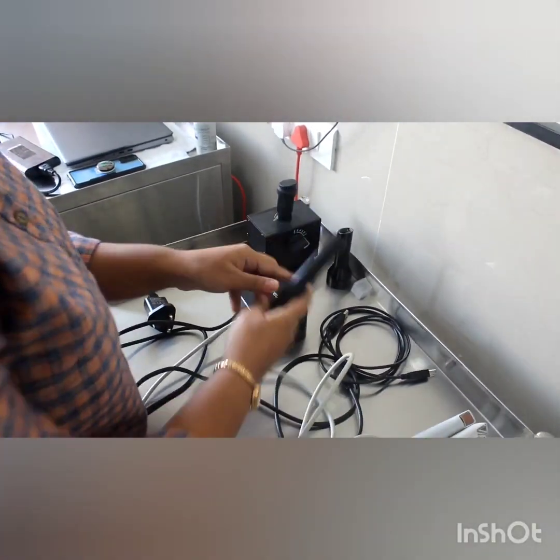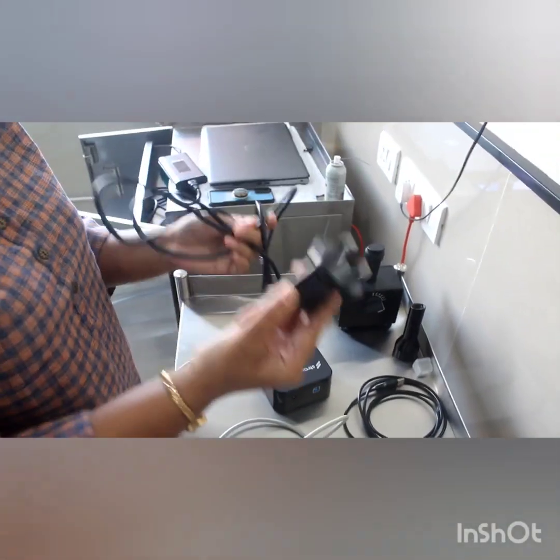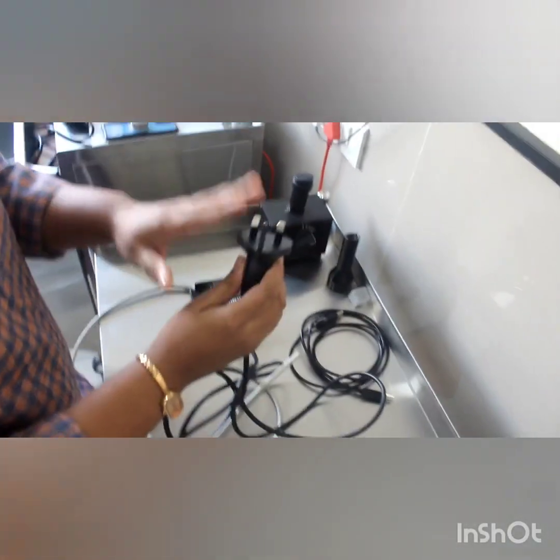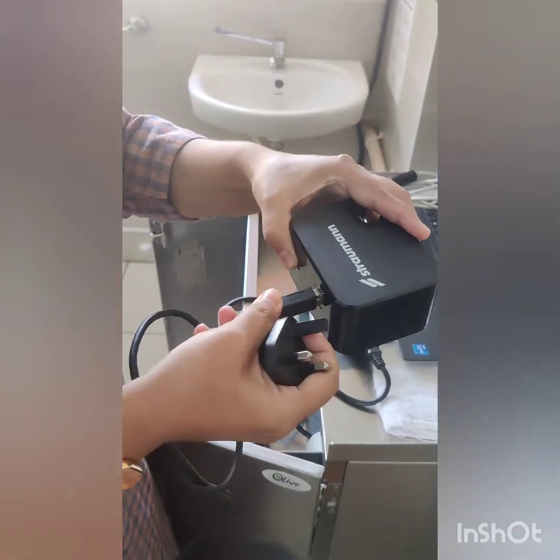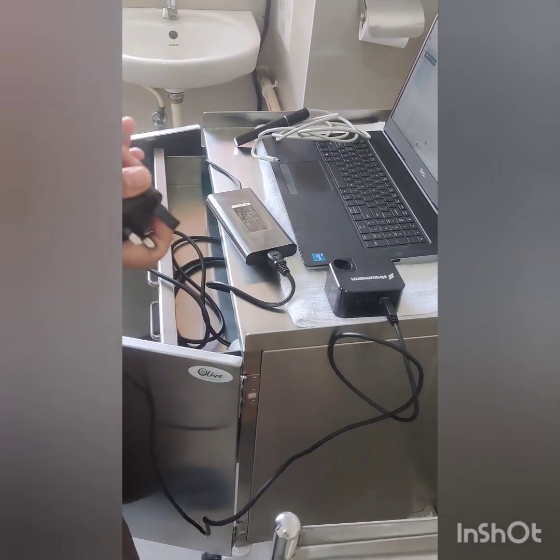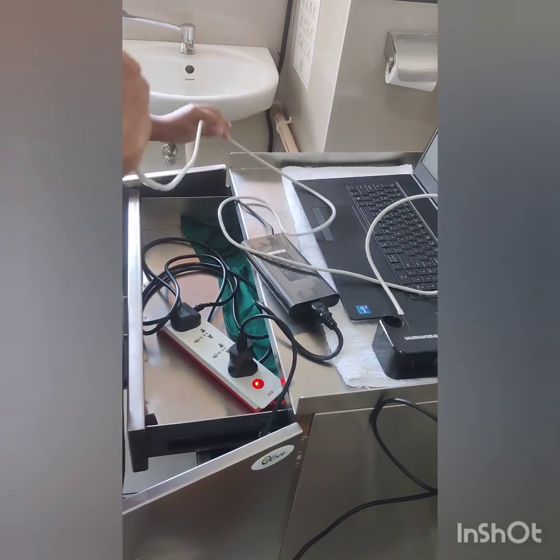From here we've got a bunch of cabling. This is a standard power cable, and where this attaches to is this data hub at the back here. And this will be attached to your power plug. We have a USB cable, and again this is going to be attached to the back of the data hub, and this will then attach to the included laptop. And finally we have the additional USB cable. Here we can directly attach, you can see that you can use it for the sharp adjust tool, and it gets attached and plugged in there and into your laptop.